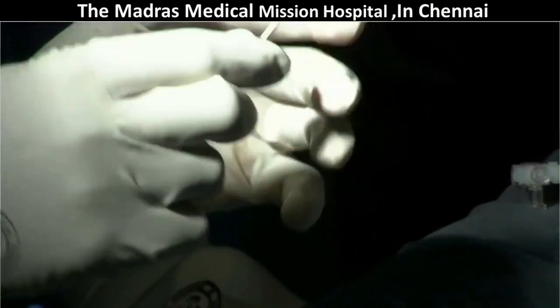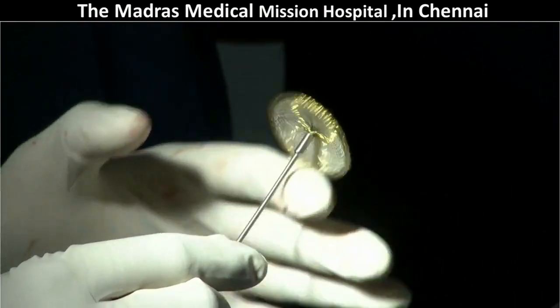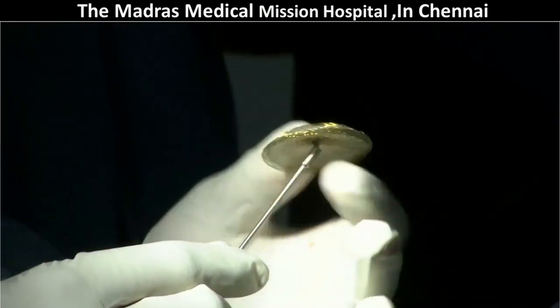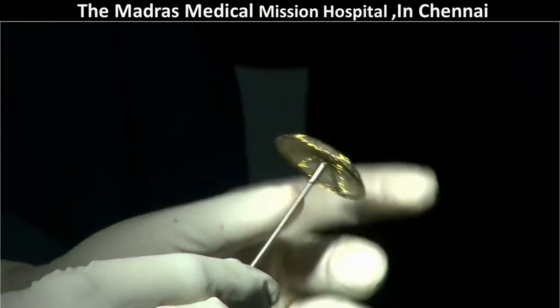So the Occlutech has got an angulation, so it will angulate according to the atrial septum. Whichever side the atrial septum is, it will get angulated. So that is the second difference.